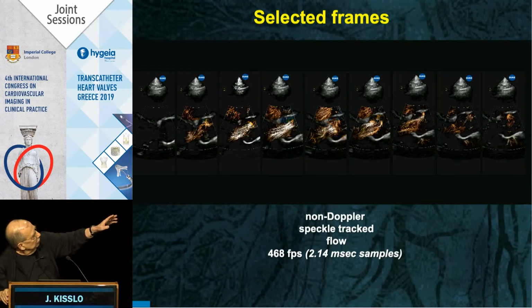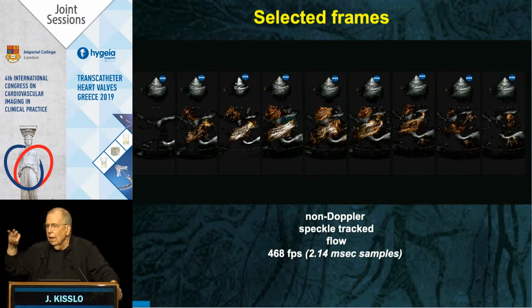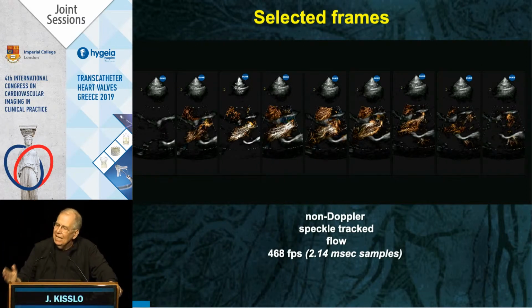And then if you look at the third one from the left, you see the flow in systole line up, getting ready to eject out of the ventricle and go directly into the right coronary artery in diastole. It's as if the ventricle, the aortic valve, and the flow know prior to diastole that the flow is going to go into the coronaries.